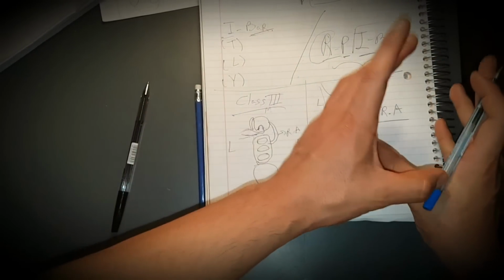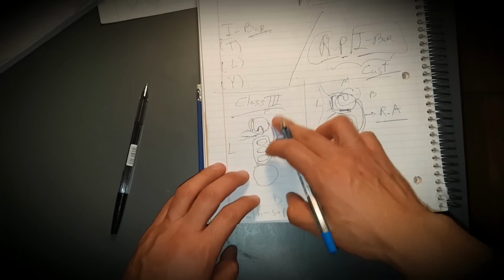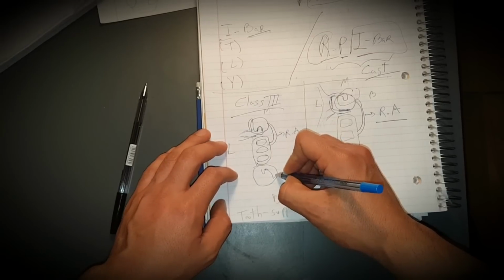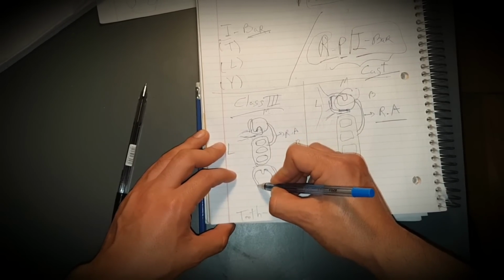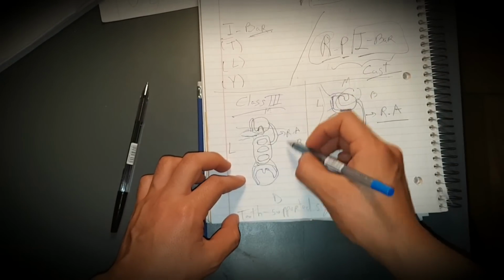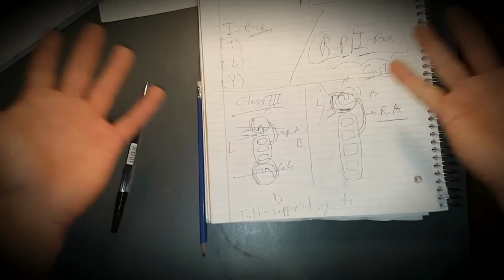That's it. Okay, so we can use this because this is tooth supported, and imagine it's a class 3, so I just put my retentive arm here and my reciprocal arm here. Tooth supported case, I have no fulcrum, and this is a cast circumferential.